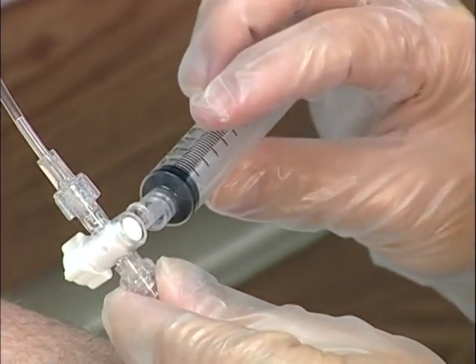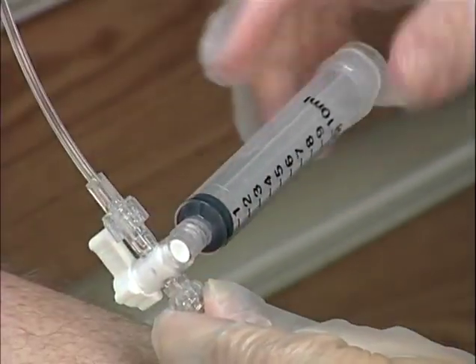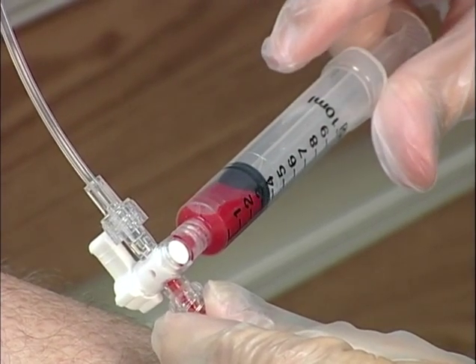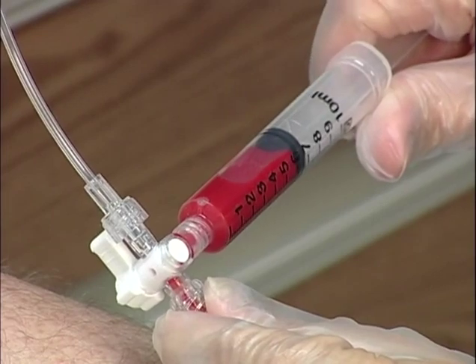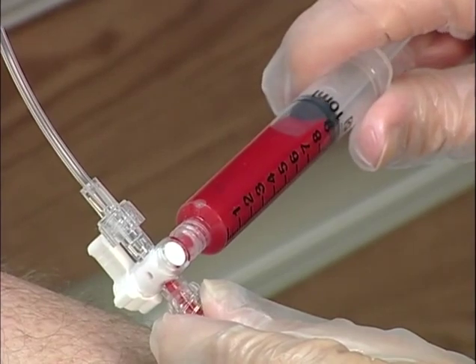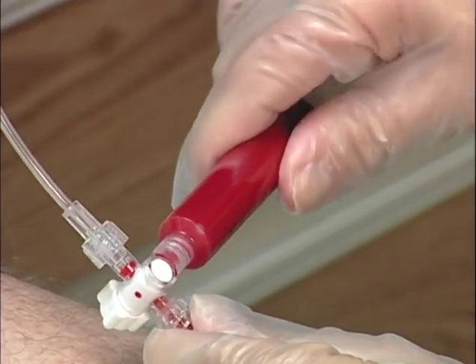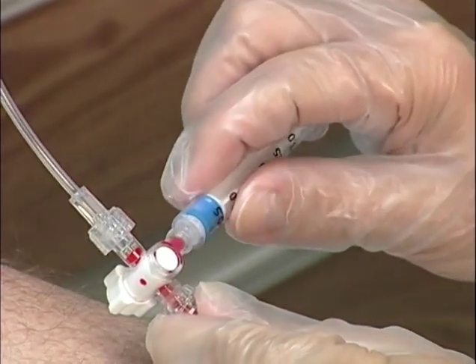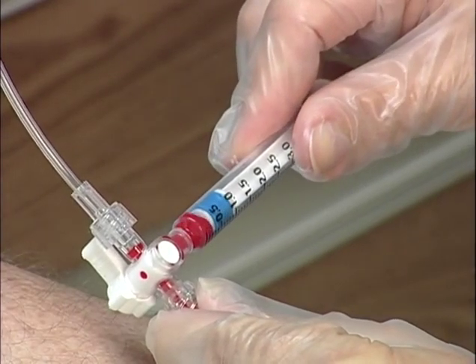Obtaining specimens from an arterial line can be a non-invasive alternative to performing an arterial puncture. However, care must be exercised not to contaminate the specimen with air or infusing fluids. Obtaining specimens from arterial lines should only be performed by those trained in the procedure. The nurse or respiratory therapist, if authorized, should withdraw 6 times the dead space volume of the line and discard, or save for reinfusing. Attach the heparinized syringe and slowly withdraw the plunger until an adequate volume is obtained. Some syringes will fill automatically.